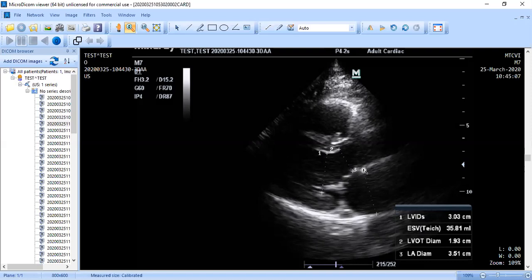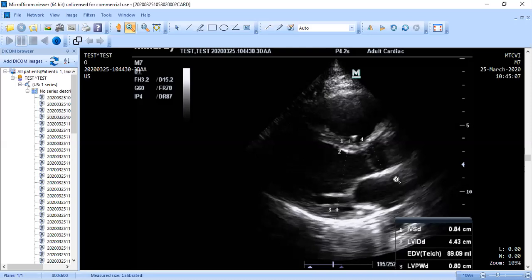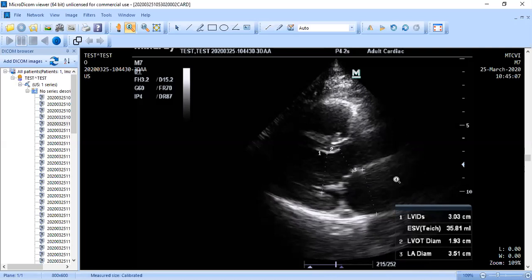All right. The other measurement we get here is going to be our left atrial measurement. So you just kind of want to go from inner edge here to inner edge here to measure that left atrium at its largest there, okay? These three measurements we get during systole, okay? So we've got our diastolic measurements, systolic measurements.